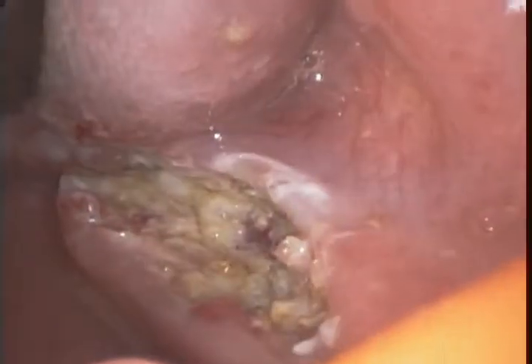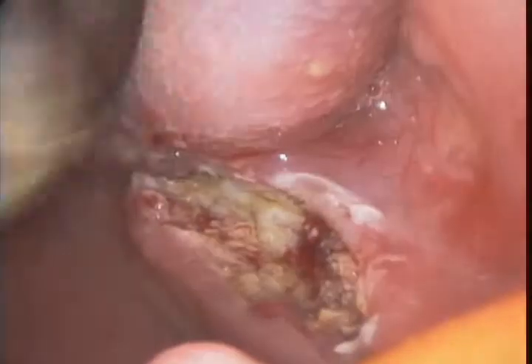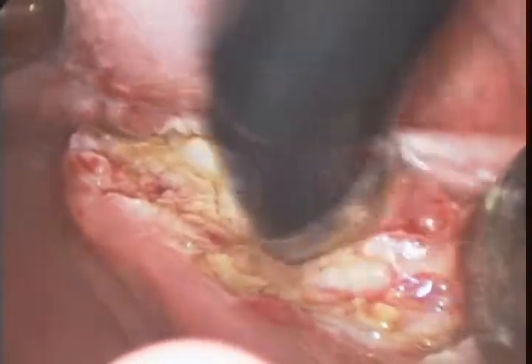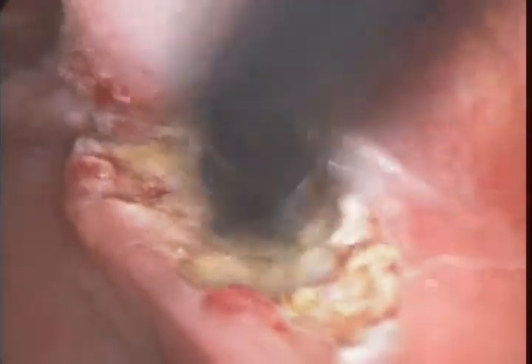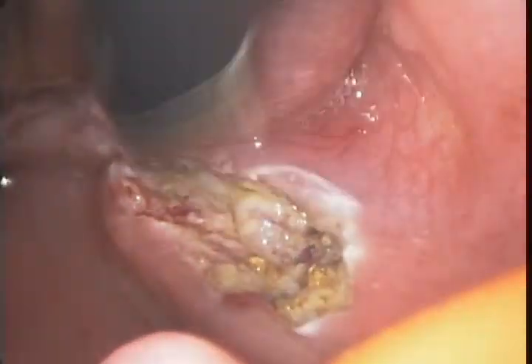And here's the concavity that we're trying to achieve. We're getting closer, so I'm going to turn the ablate setting back down to 6. And I turn the ablate setting down to 6 when I think that I'm getting very close to the capsule. And we just use the lower power setting to remove the very last final layer that's over the capsule.